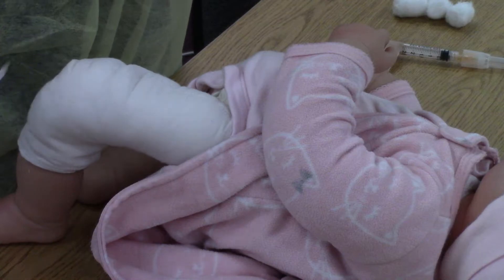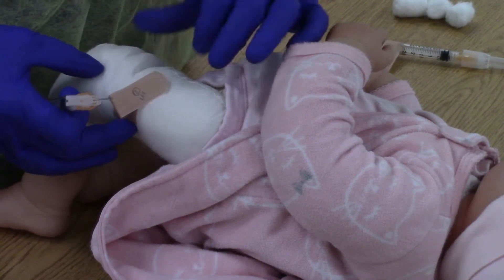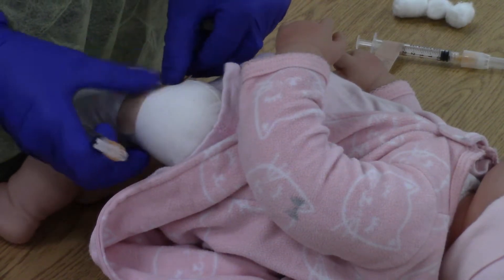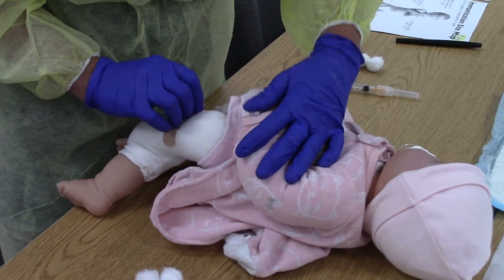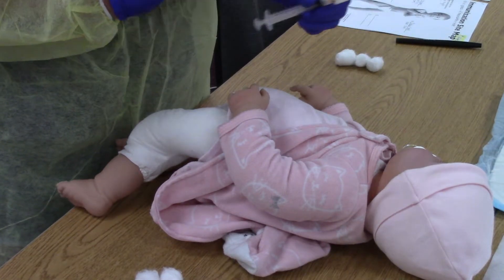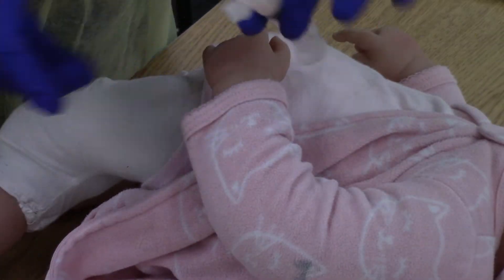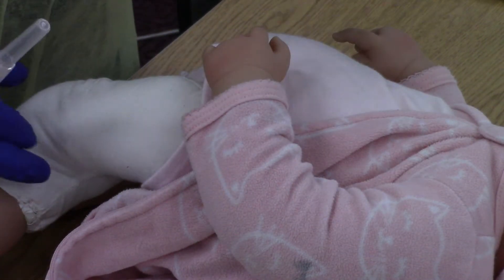Activate the safety and put a band-aid on — it won't stick to cotton. For subcutaneous injection, I'm using the same leg for the camera, but you do need to space injections one to two inches apart. I labeled this one 'left sub-Q' — I would normally give it on the left side, but I'll demonstrate on the right side for the camera.